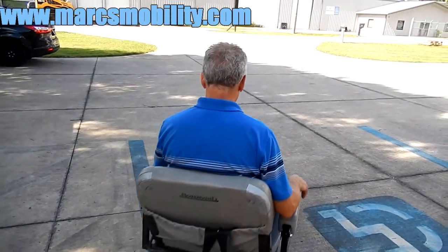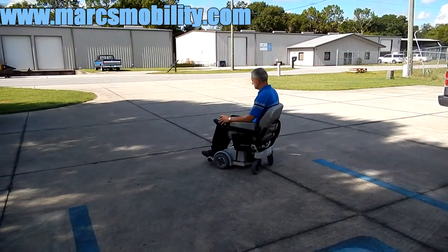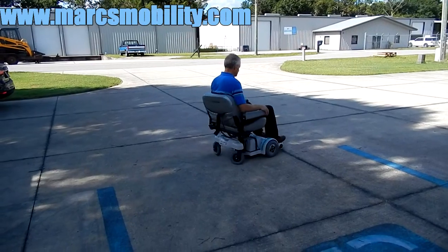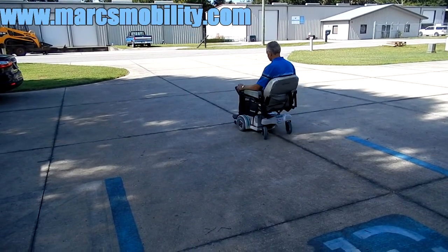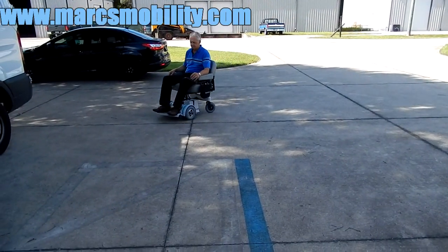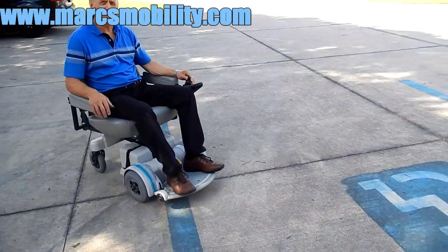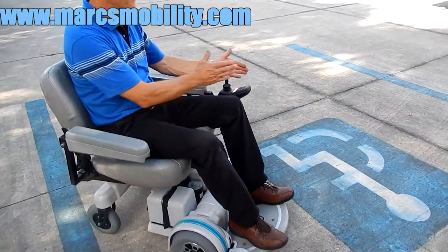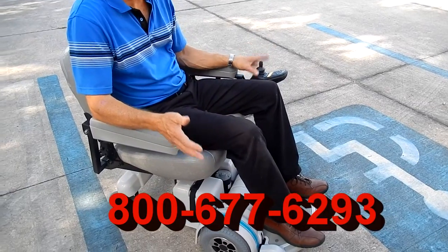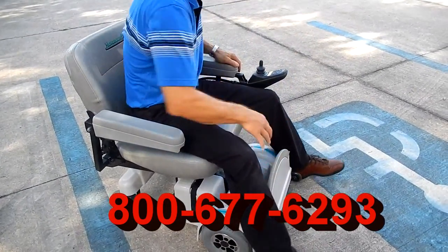This is the Hover-Round in practically new condition with the seat lift — this chair is ready to go. It's a very smooth riding chair. If you need to switch the joystick from the left side to the right side, that's no problem at all. Easy exiting this chair by flipping the footplate up.